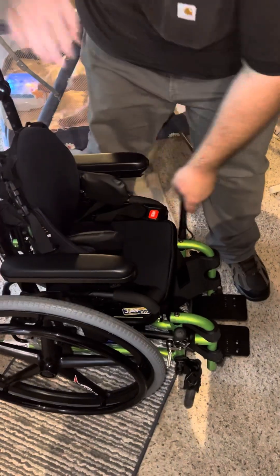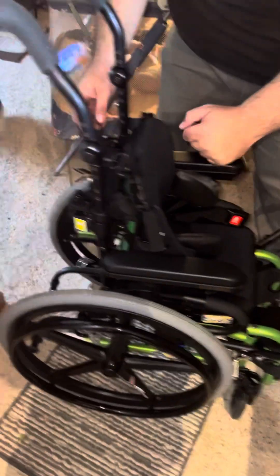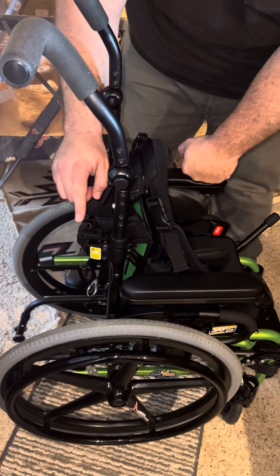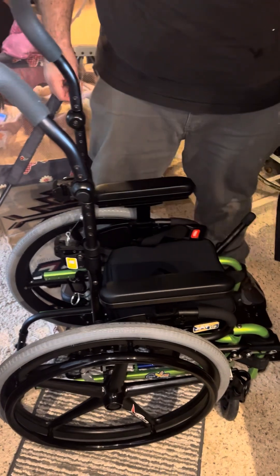To take it apart, lock the wheels back here. On both sides there's that little tab. It sits forward and the whole thing comes off.